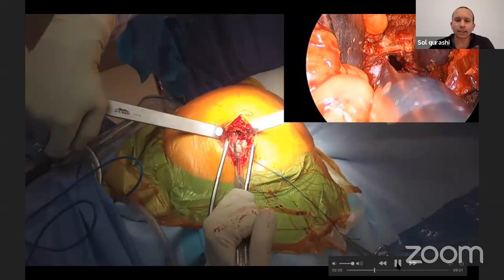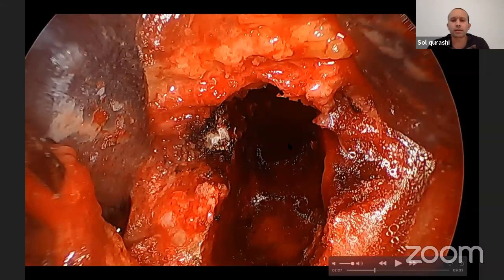So here I'm looking at the femoral canal in there. That's the front of the femoral neck, that's the back. So that's my saddle. That's something I can see on the X-ray as well, my pre-op templating. That's as well, but this is the most prominent one. This is the one you see on the X-ray. I've cut out a little channel here and there's my femoral canal straight down.